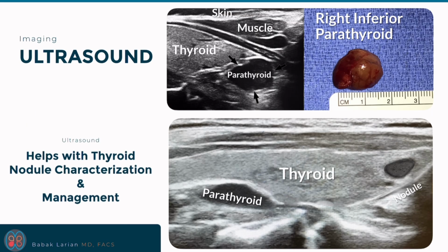And ultrasound can also show you thyroid nodules, right? And you can decide if during the surgery, I can remove the parathyroid and maybe go in there and just scoop out that nodule without harming the rest of the thyroid. So it really gives you a lot of good information.